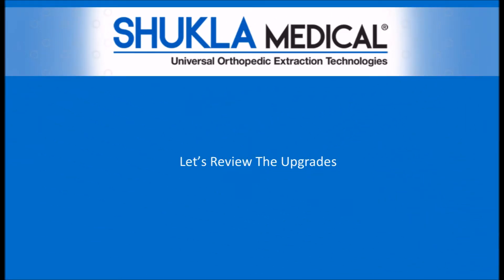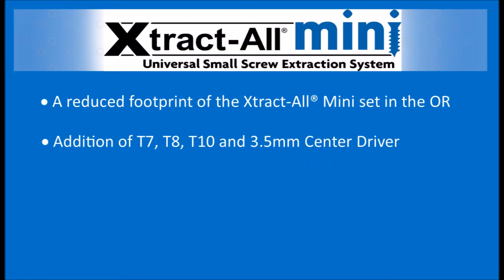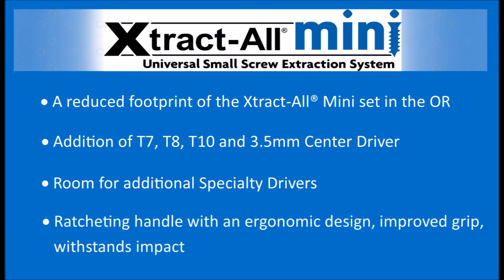Let's review the upgrades again. The lid is now removable. There are four more drivers of various sizes. Six additional slots for specialty drivers. And an ergonomically designed ratcheting handle, reinforced with an improved grip to withstand impact.